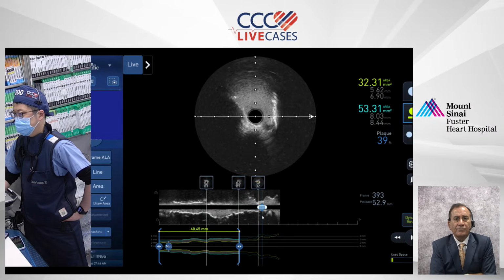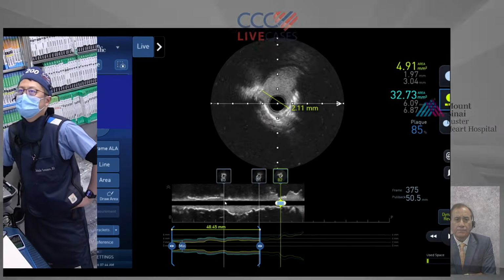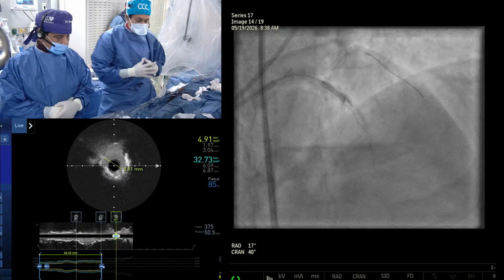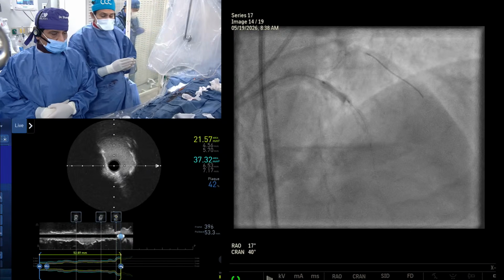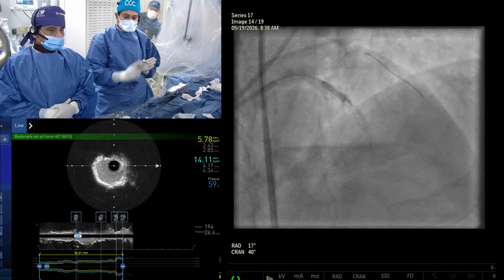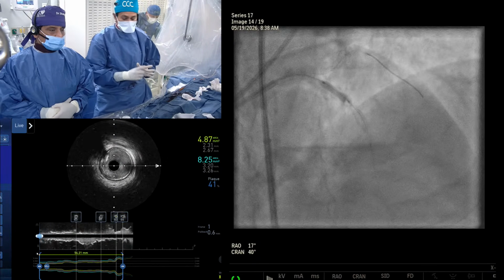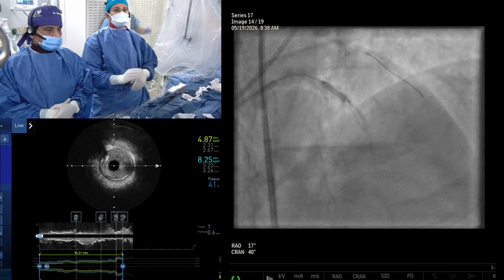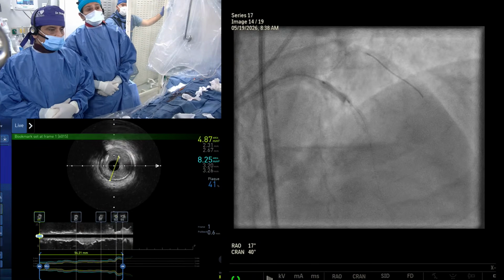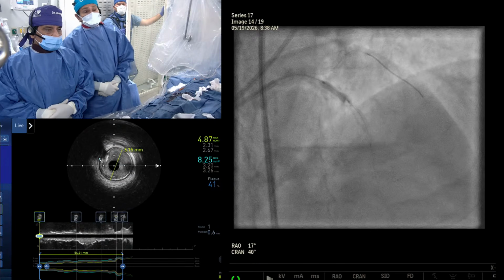When we are doing rotational atherectomy, I still think the good old rotational atherectomy is very safe. The physics principle is that there is deflection of the normal tissue when the Rotabur rotates. It rotates, not orbits. When it rotates, there's deflection of the non-calcified tissue. But here you don't see that, because when the ultrasound waves go out, yes, they act if it is calcified.